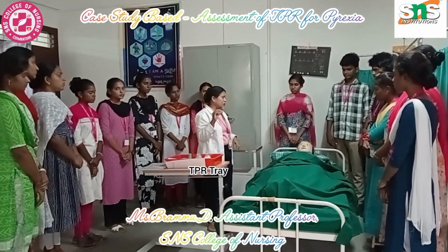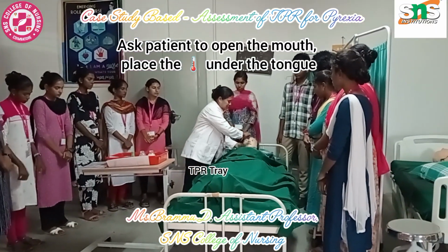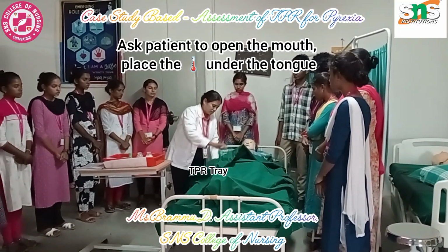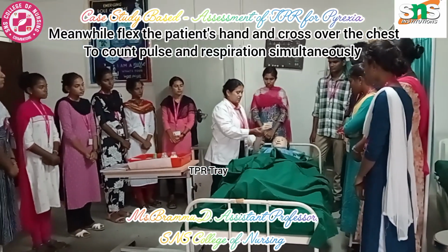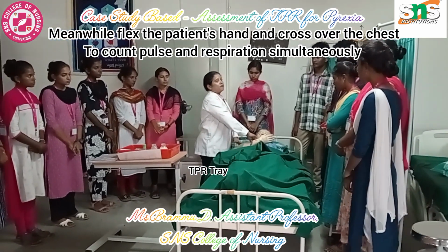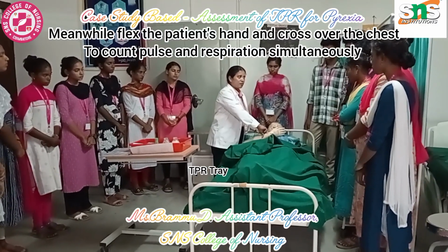Then after you confirm, if it is oral, ask the patient to open the mouth, put it under the patient's tongue and ask the patient to hold it. Meanwhile, we can have the patient's hand slightly raised and kept onto the chest. Why are we keeping it this way? For the first minute we are checking the temperature, and simultaneously you will be assessing the radial pulse.